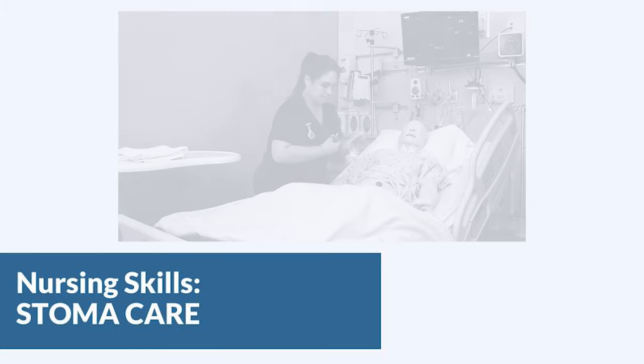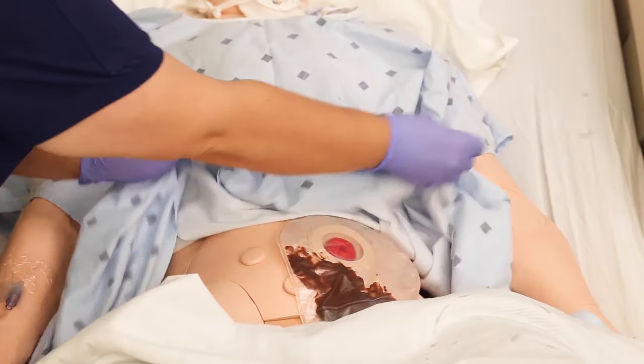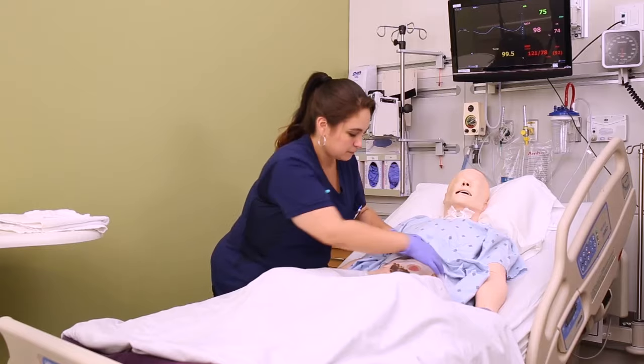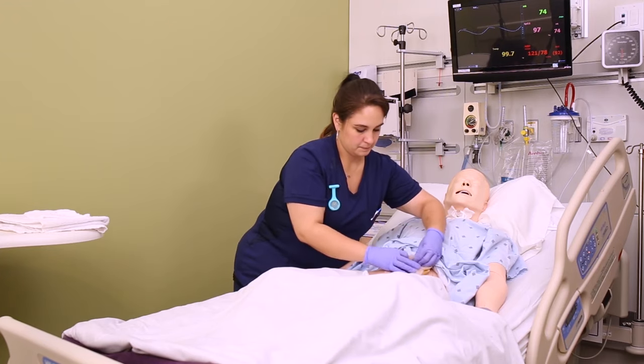You want to start by putting a towel under the patient on the side of the stoma. Then the first thing you want to do is assess the output from the stoma, so if you have a clear bag you can actually see the output through the bag and visualize it that way.